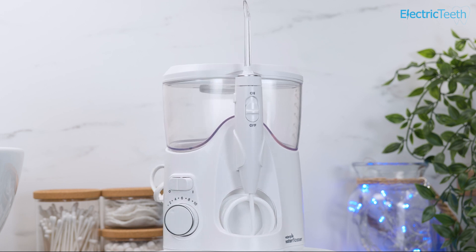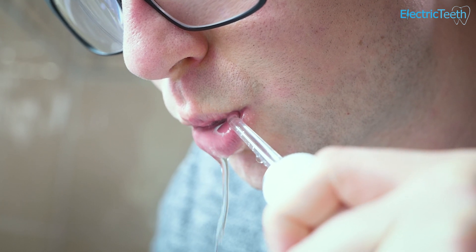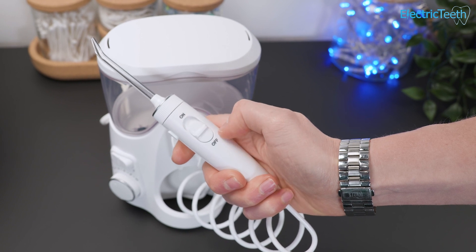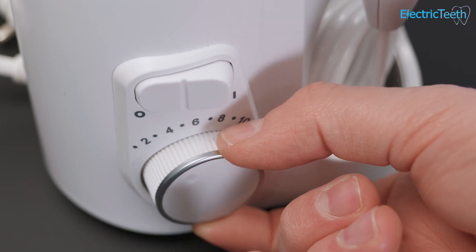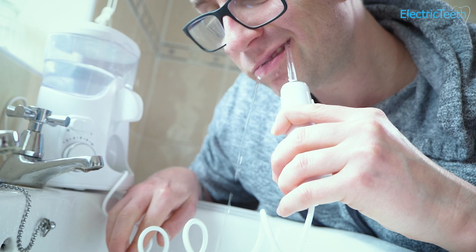The Ultra Plus is a great countertop water flosser. It cleans in between the teeth and along the gum line really well. The slider switch on the handle to control the water flow works well. The rotating nozzle is simple to use and the 10 pressure settings gives plenty of choice. I could happily use the Waterpik Ultra Plus on a daily basis.